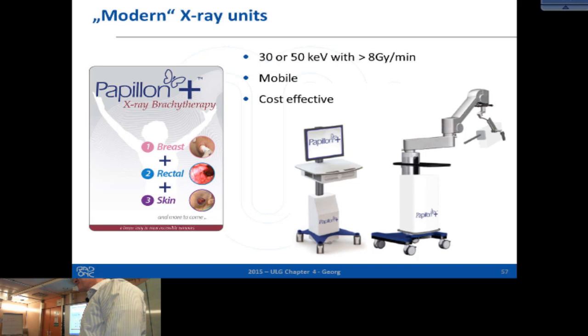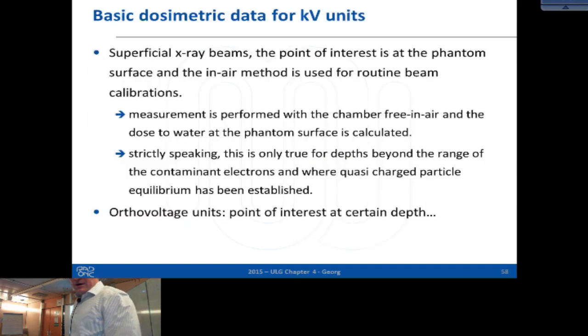Treatment from a short distance, bringing basically the target in contact with the lesion, they call it brachytherapy in a way, or X-ray based brachytherapy. So this was just a small excursion through the X-ray units, but most of what you read is actually what I explained during my 10-15 minutes during the practicals. Basic dosimetry.